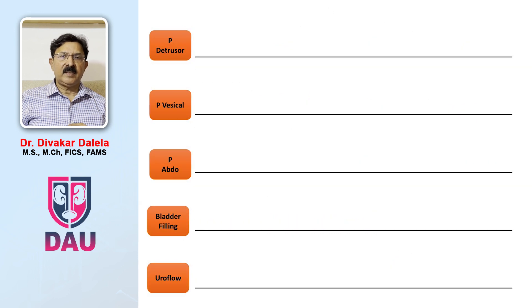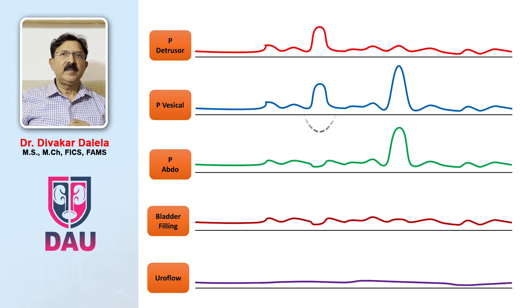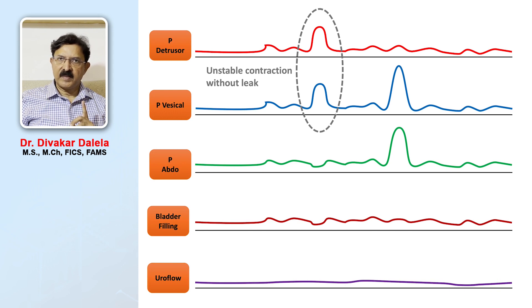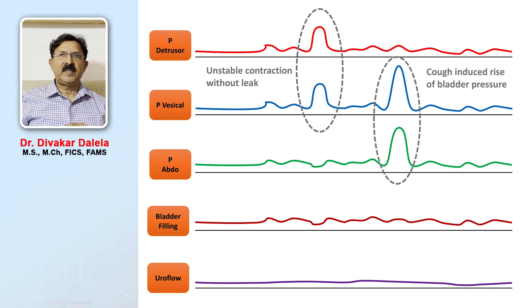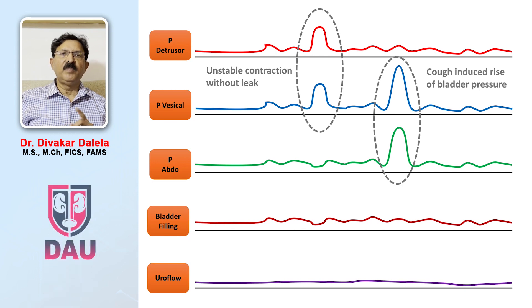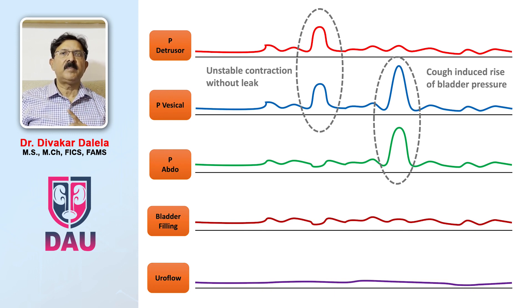In another example, you see the filling phase going on and that is how the pressure lines show the change. This is the unstable contraction without leakage — unstable contraction because the P-detrusor line moved up, P-vesicle line moved up, nothing happened on the P-abdominal. But in the second event, P-abdominal moved and P-vesicle moved, but nothing happened to the detrusor line. So this is a cough-induced rise in the bladder pressure. This is not an unstable contraction.